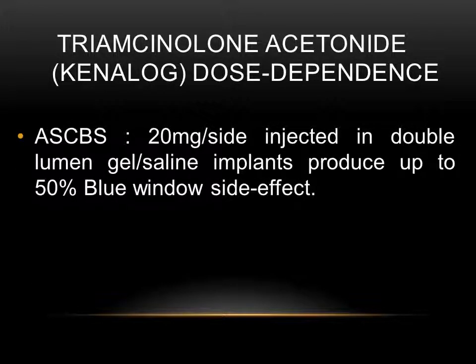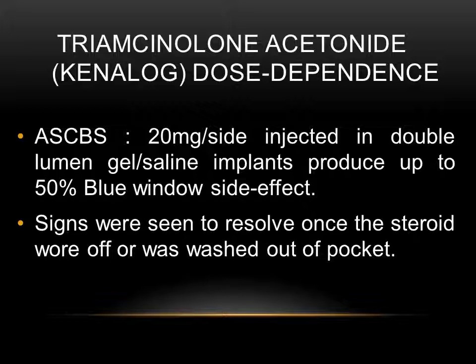For example, information provided by the American Society of Cosmetic Breast Surgery, based on some of their work, showed that the use of Kenalog, which was injected with 20 milligrams per side into a double lumen gel saline implant, produced up to 50% blue window side effects. These side effects were seen to resolve once the steroid wore off or was washed out of the pocket.